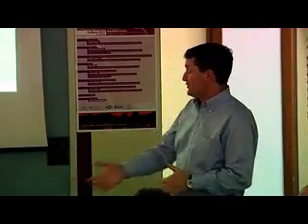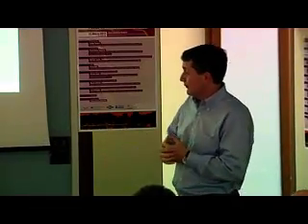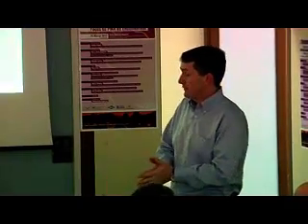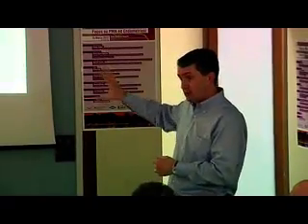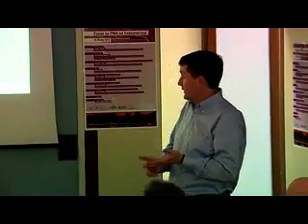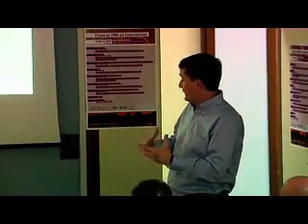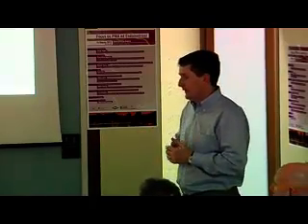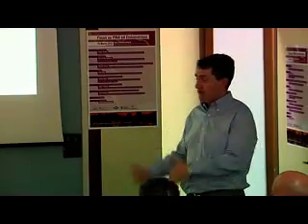Now, for those patients who have very small numbers of embryos, if we want to do a single embryo transfer, we think that's in the patient's best interest, we can vitrify the surplus embryos at earlier stages. We don't have to wait until day 5 to do the vitrification. This procedure, the exact same protocol, works very well with zygotes, with fertilized eggs, works very well with day 2 embryos, works very well with day 3 embryos. So this protocol is very flexible, and you can use it for any embryo at any stage, and it seems to work really well. Now, to go back to your first question, the differences between traditional cryopreservation and vitrification.